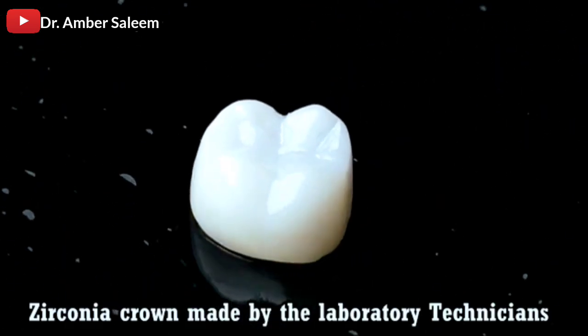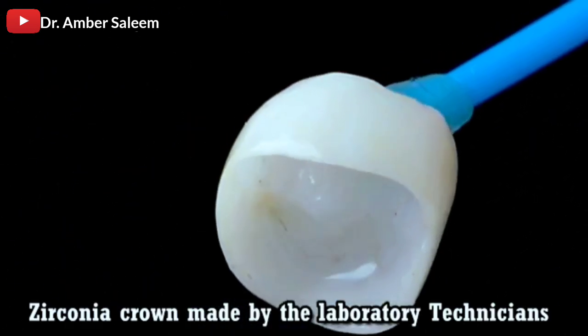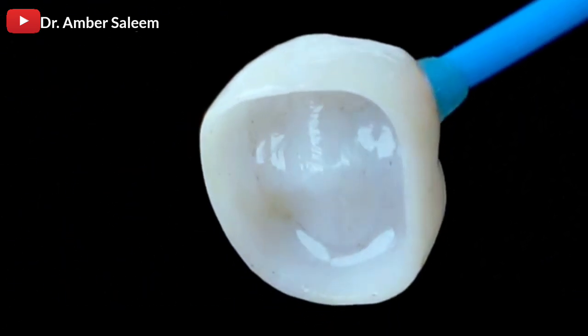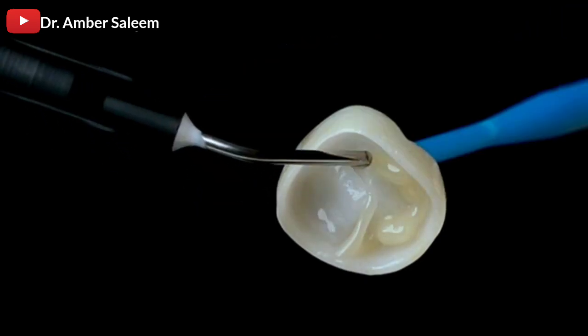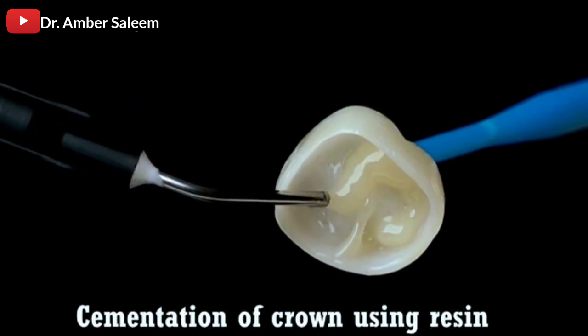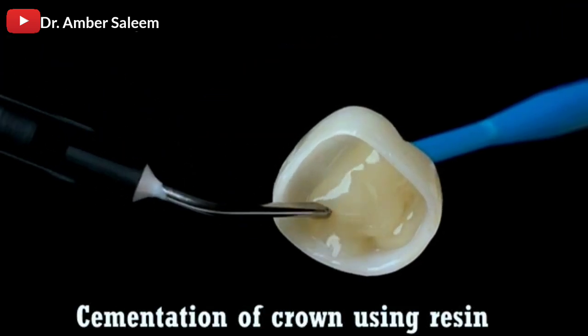Zirconia crown made by the laboratory technicians. Cementation of the crown using resin cement.